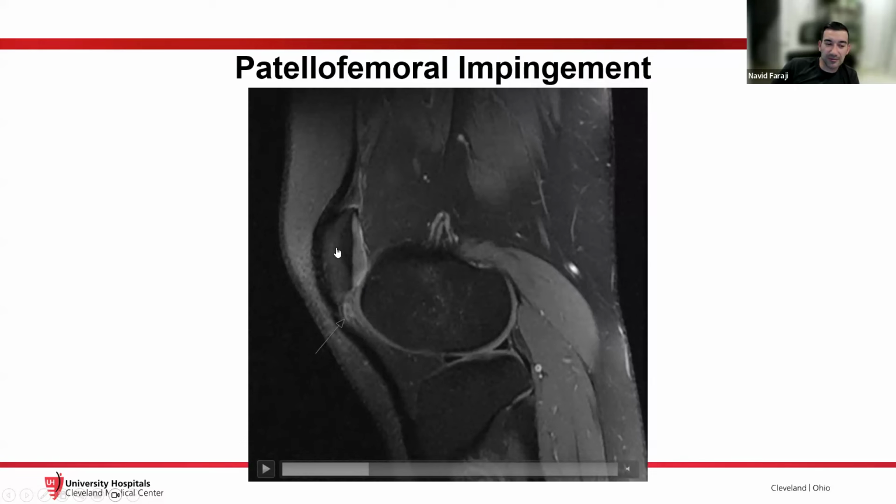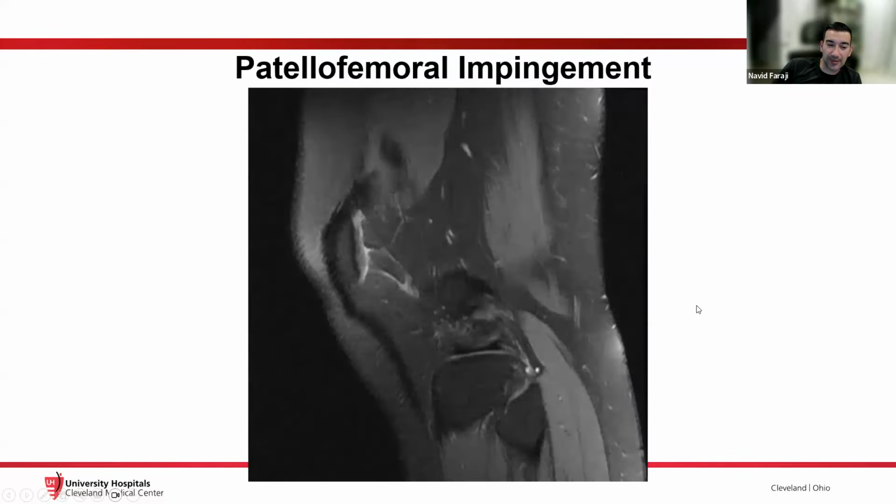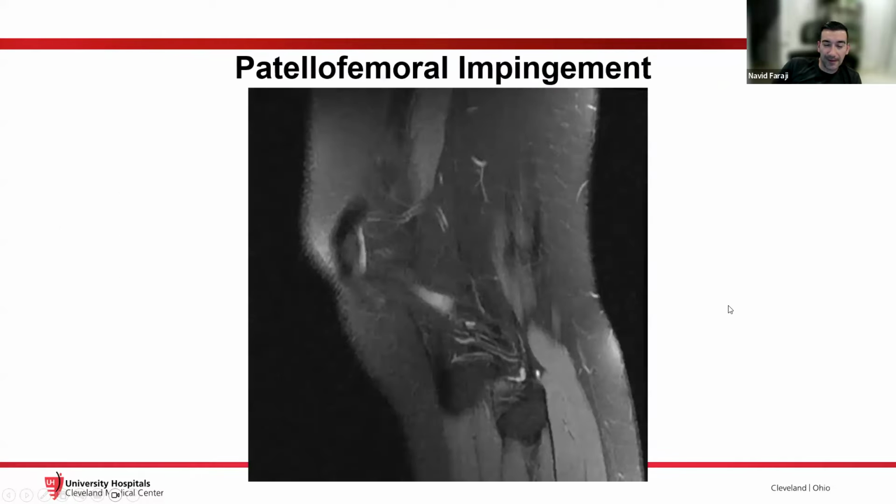So this patient may need some PT to strengthen their quad muscles in order to provide some counter traction to bring this patella more central rather than tracking laterally. So look for this lateral Hoffitis or edema in the supralateral aspect of Hoffa's fat pad.